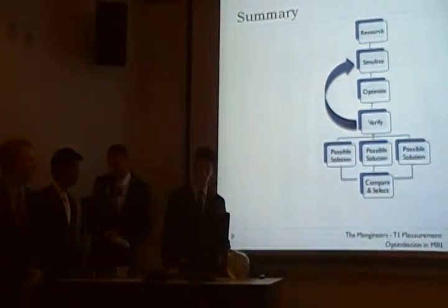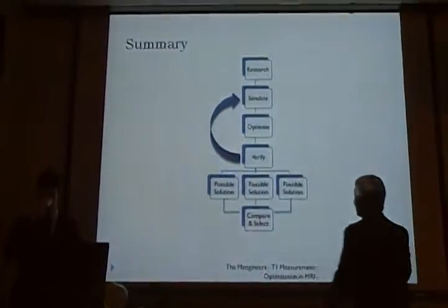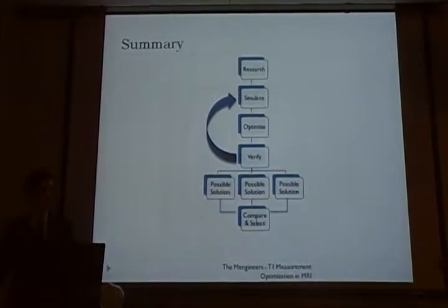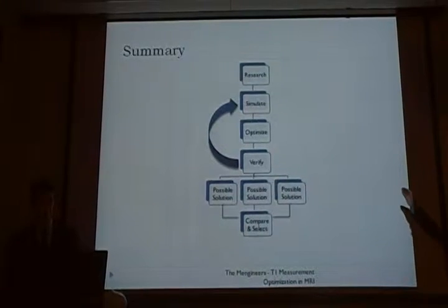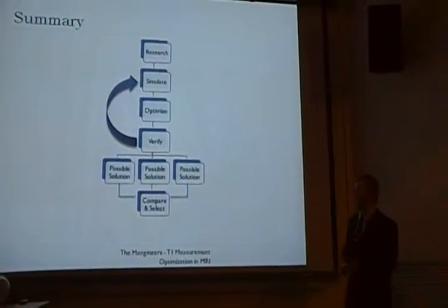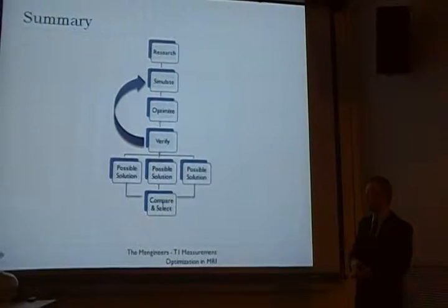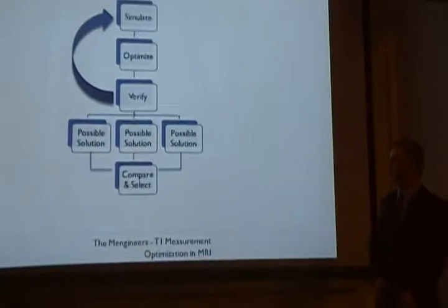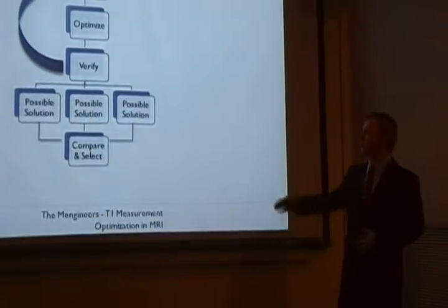And so, in summary, our basic approach to the whole optimization was to first research and try to figure out how the MRI works, which is pretty complicated. And then we simulated the DESPOT signals, or figured out how to simulate the MRI. And then we started picking points and running optimizations, figuring out how they interact with each other and how they converge, and started using the information matrix and a couple other variants of it.